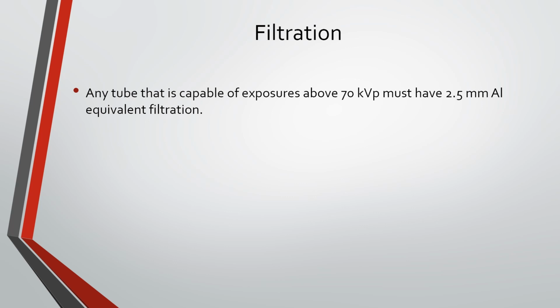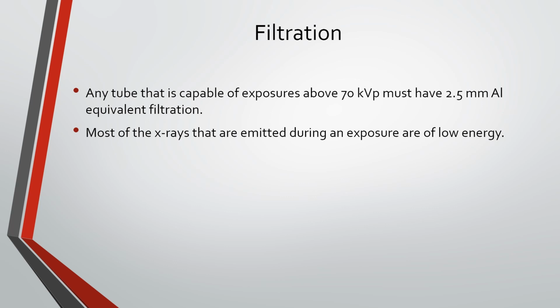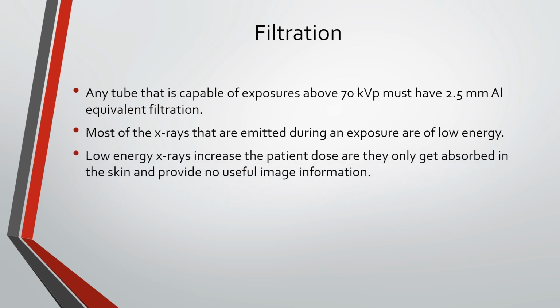And so why would we do that, right? It's not for nothing. Most of the X-rays that are emitted during the exposure are of low energy. In the third video of this series, we learned about the X-ray emission spectrum. If you're unfamiliar with this or need a review, I recommend that you watch it now. So we learned that most of the X-rays emitted are of low energy.